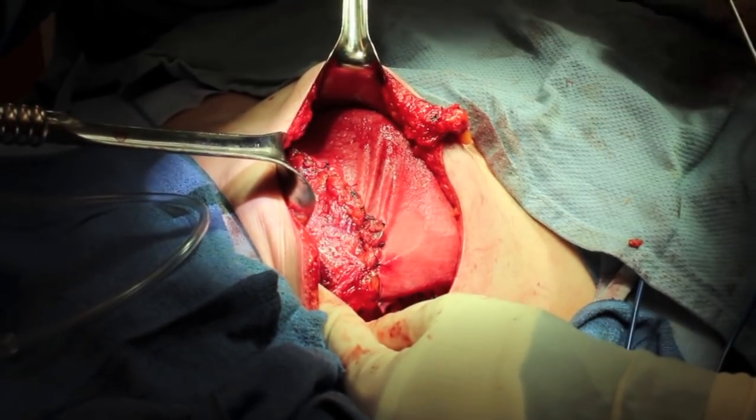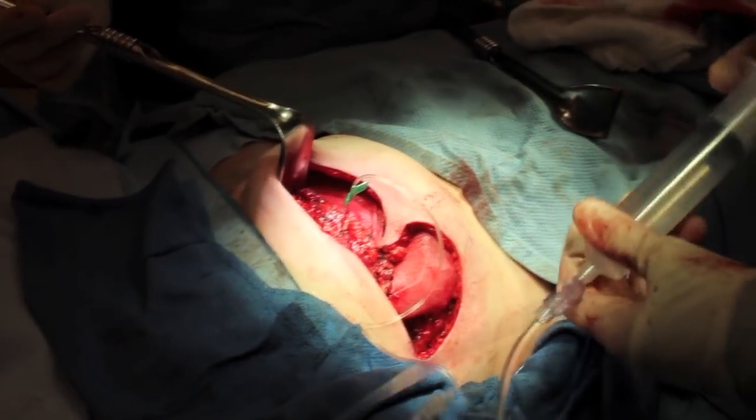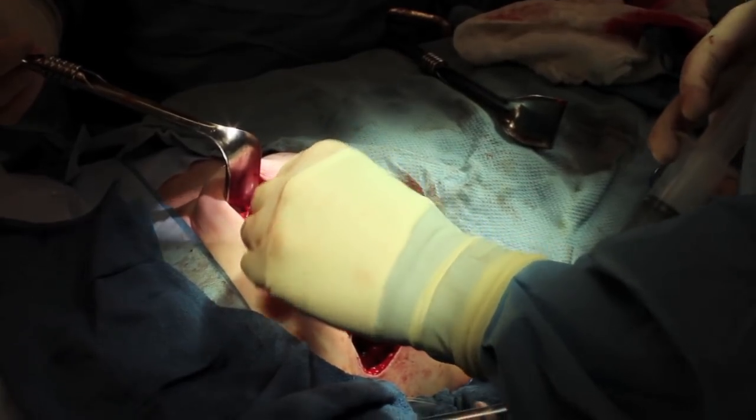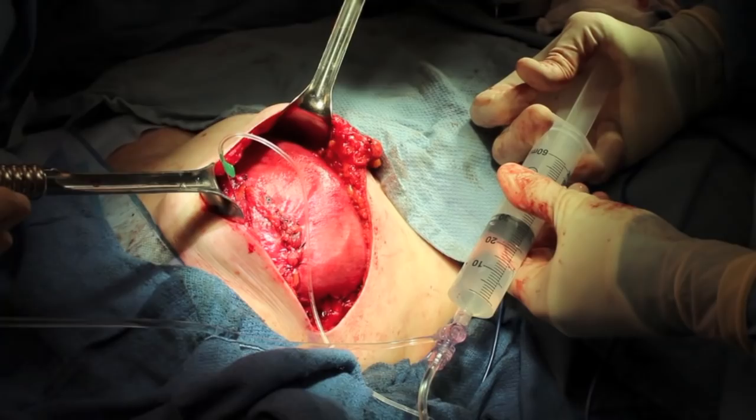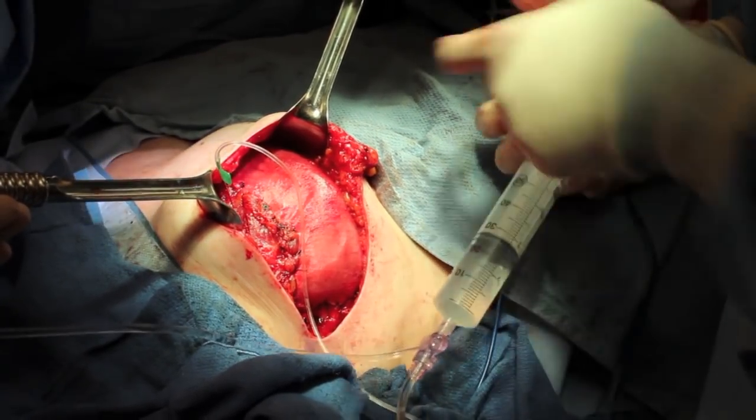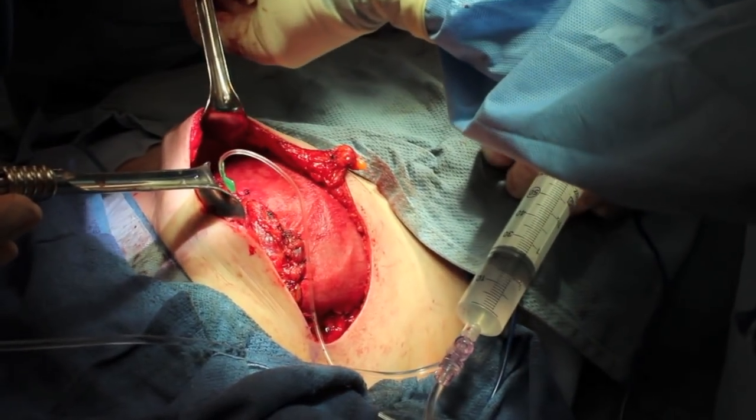Afterward, we see the port circled here. And we'll access that with a needle. And then we'll start to insufflate the tissue expander with saline. Here, the tissue expander has been insufflated with a moderate amount of saline.